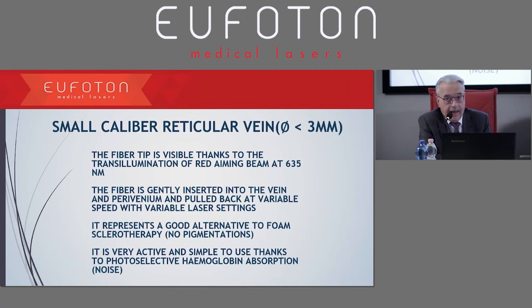And for the small reticular veins, with a diameter lower than 3 millimeters, what is important to underline? Well, the transillumination and polarized light that allow us to visualize these small veins in the dermal layer.